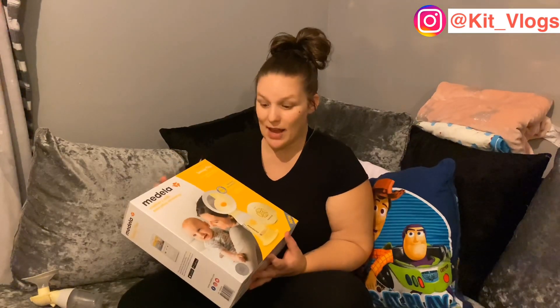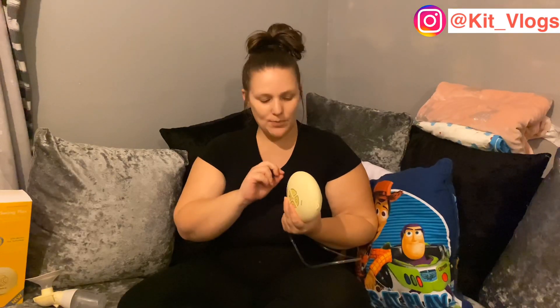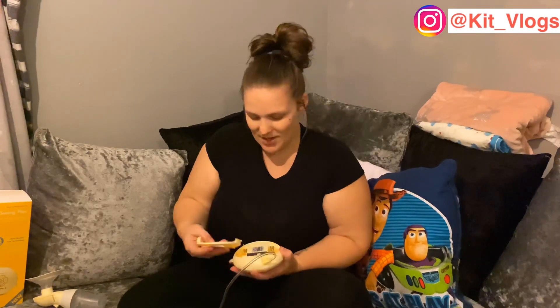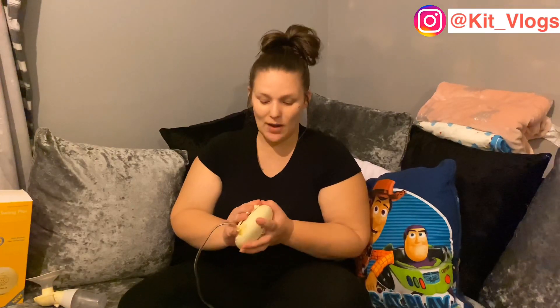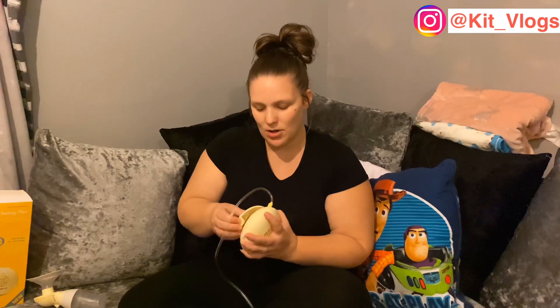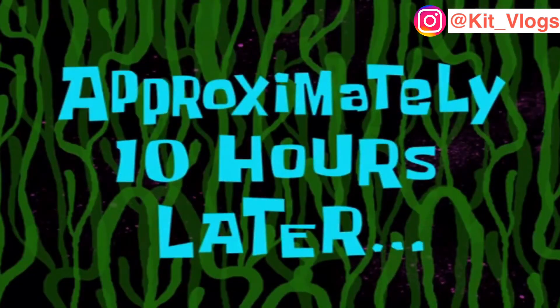So it comes with the pump. You can use it two ways — my adapter's plugged in, but you get an adapter so you can plug it into the mains, or you can use four double-A batteries so you can use it on the move — in the car, at work, or wherever you don't have mains. I haven't used that function yet but I will.